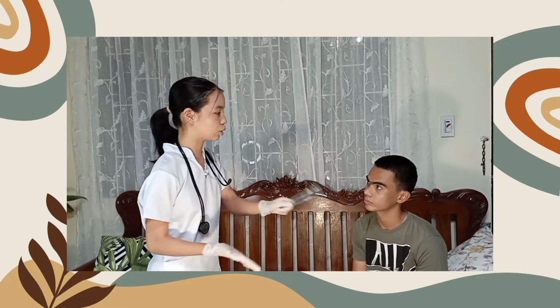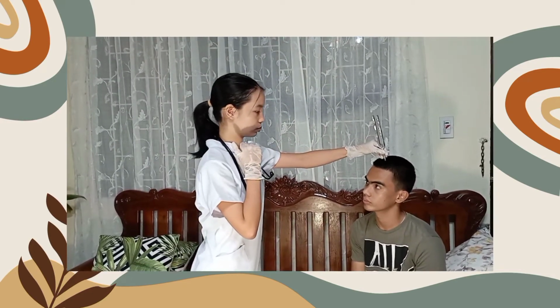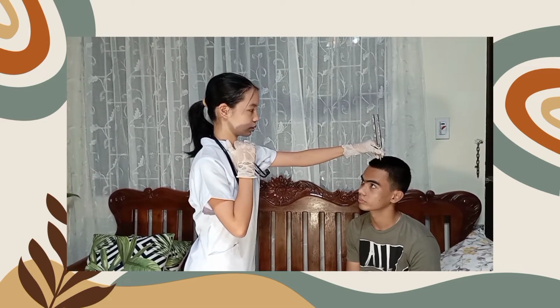So for the last part of this assessment po, we'll perform the Weber's test and the Rinne test. Okay, sir, let's start po with the Weber's test. So sabihin niyo lang po sa akin kung saan niyo po naririnig, kung sa left side niyo po ba, or sa right side, or kung both po. Okay, sir, paano mo start? So saan niyo po naririnig yung vibration, sir? Both sides. Okay, so for the next one po, we will perform the Rinne test.